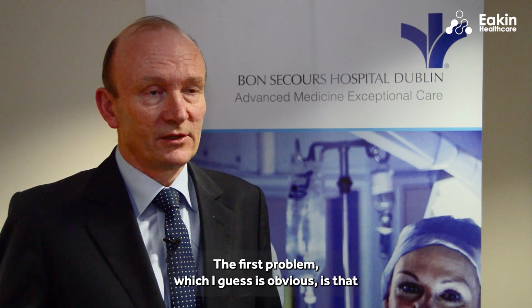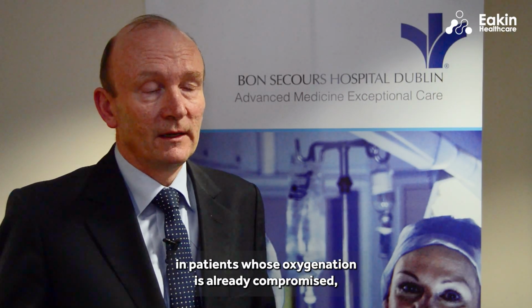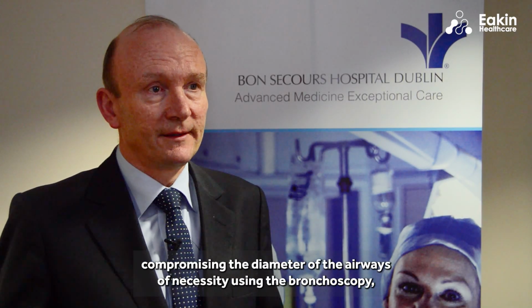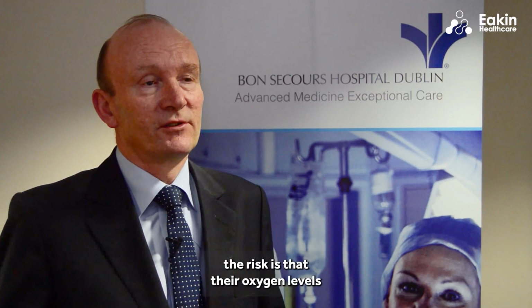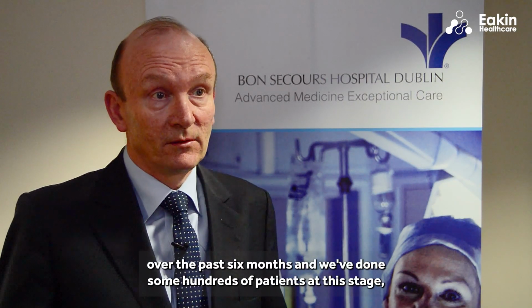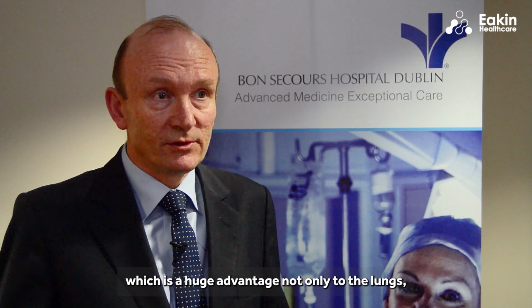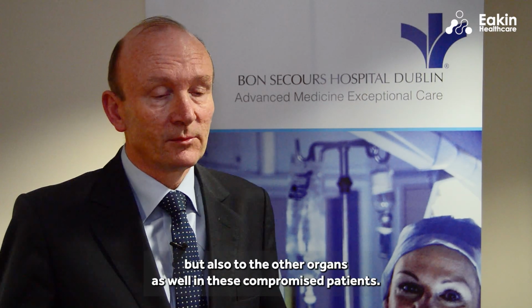The first problem, which I guess is obvious, is that if you're putting a tube, albeit a small one, into the airways, in patients whose oxygenation is already compromised, in other words, their blood oxygen levels are low to begin with, and you're now compromising the diameter of the airways of necessity using the bronchoscopy, the risk is that their oxygen levels are going to fall further. Effectively, in my experience over the past 6 months, and we've done some hundreds of patients at this stage, the high flow system effectively prevents the oxygen levels dropping, which is a huge advantage, not only to the lungs, but also to the other organs as well in these compromised patients.